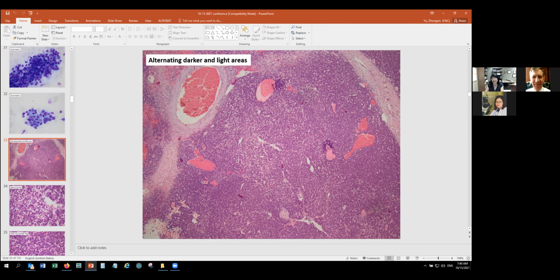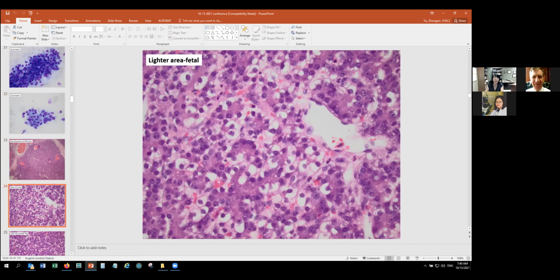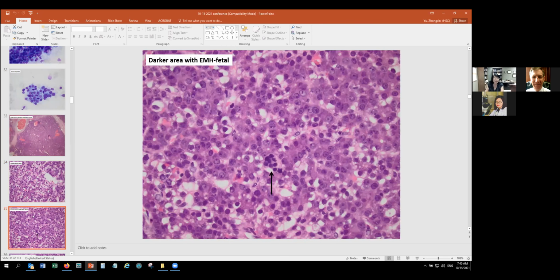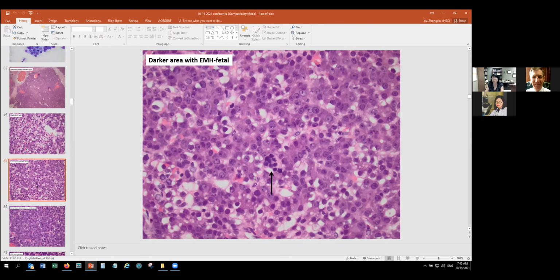For this specific case, D5 has a dark area and light areas, kind of fetal type hepatoblastoma, and on close look the same. Hepatoblastoma in general looks similar, especially fetal and embryonal. So you get this fetal liver cell looking, some light area. What I want to show you is that these cases have lots of extramedullary hematopoiesis.